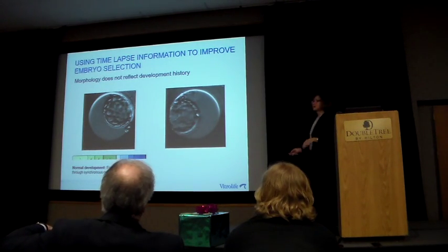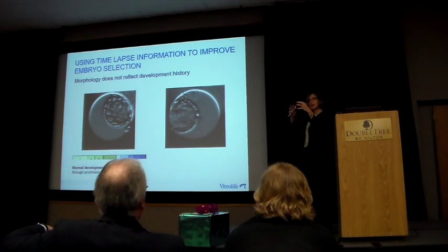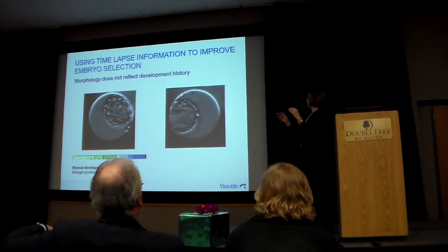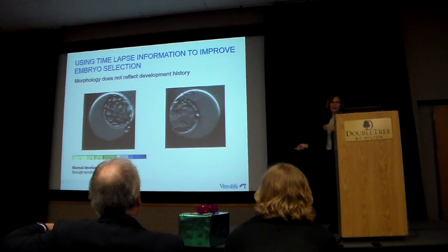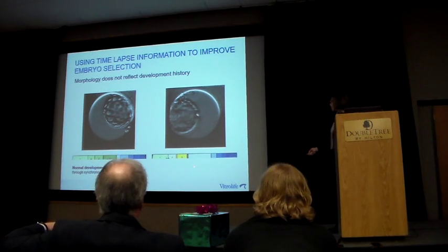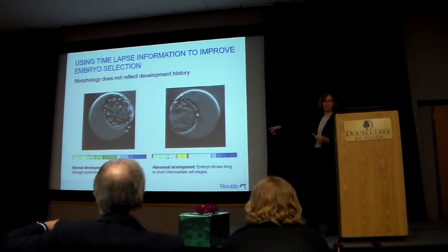This is the one that went from 1 straight to 3. And then it stayed at that for like half of the day, and it shouldn't have taken that long. And then it kept dividing. But it still made it to that day 5 step. But through the tools of the software, we see a totally different graph. And even from the back of the room, you guys can pick that those 2 color graphs are completely different.